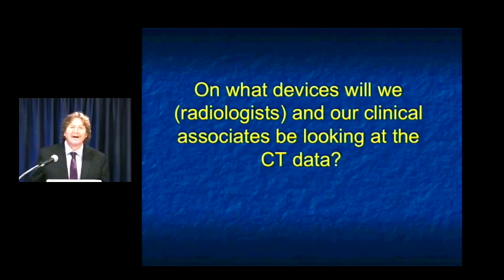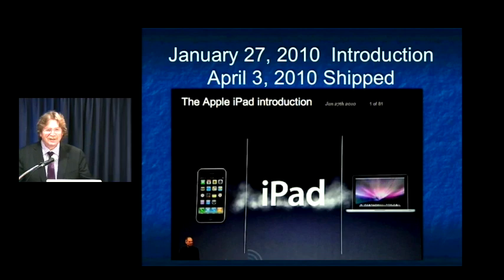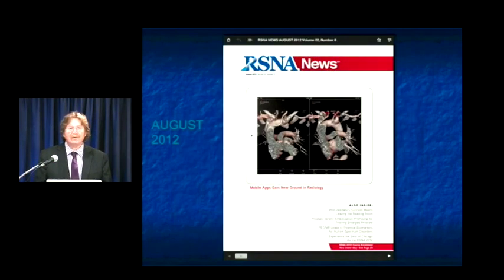We talk about devices, how we look at things. I mentioned our initial 3D workstations were $400,000, but things change. The iPad came along, and you say, well, so what? How will that help us in medicine? Well, the iPad and the iPhone, particularly the larger iPhone, which to me is the 6 Plus, a mini iPad, allows us to look at images anywhere and everywhere.